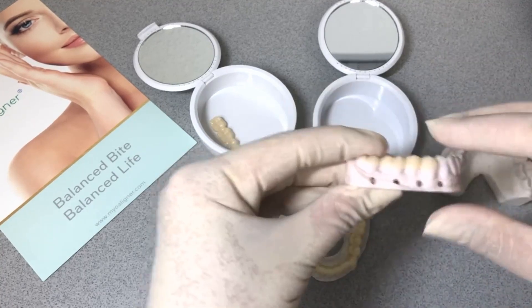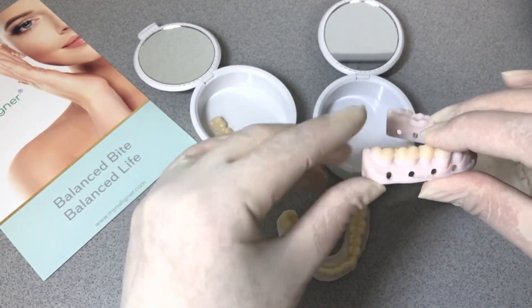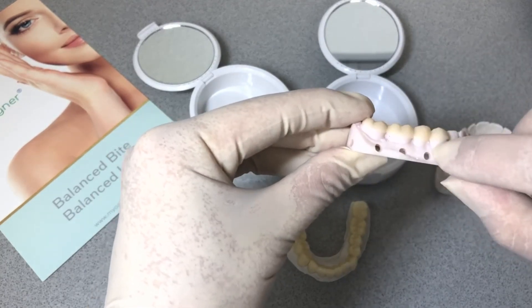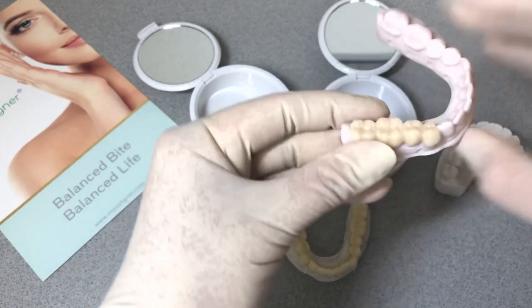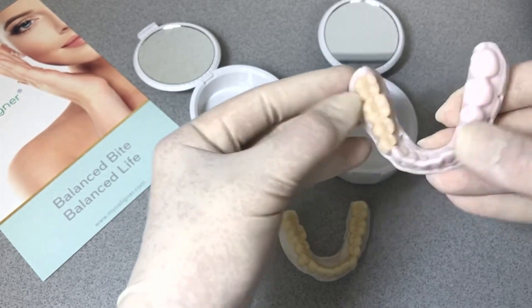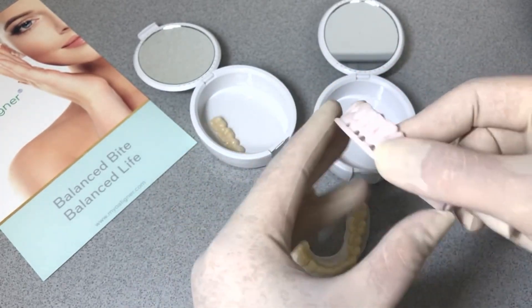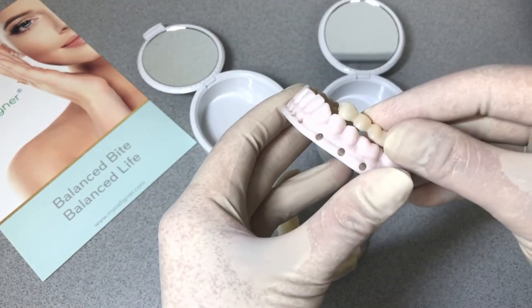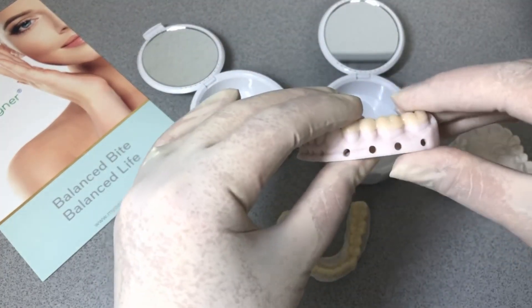As you see, we stop kind of barely past the height of contour. That way the patient can floss or water pick in this area, because I would recommend this design to be temporarily cemented on the teeth. It just makes the transition into phase two easier.